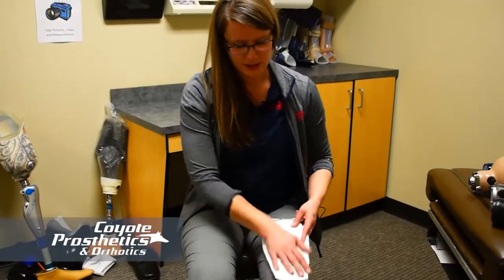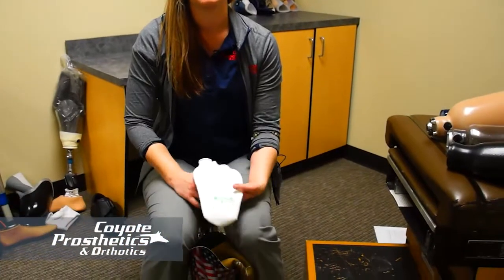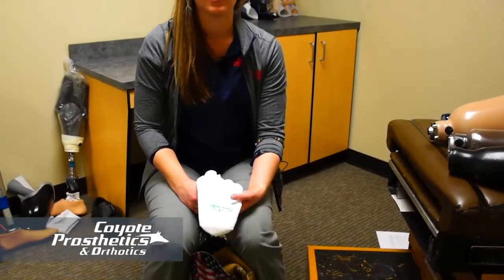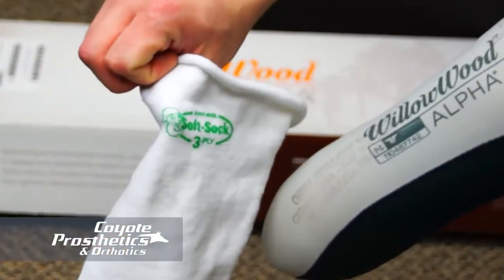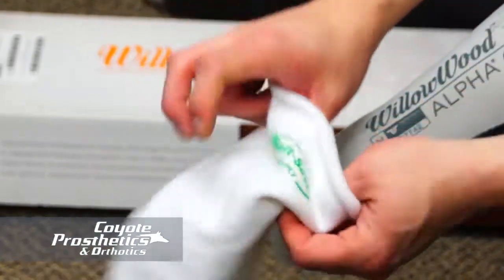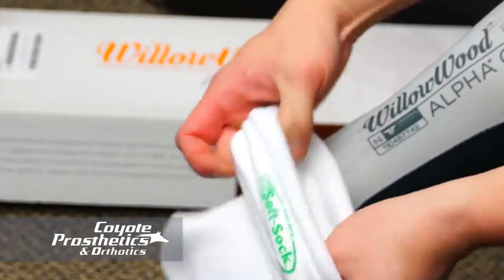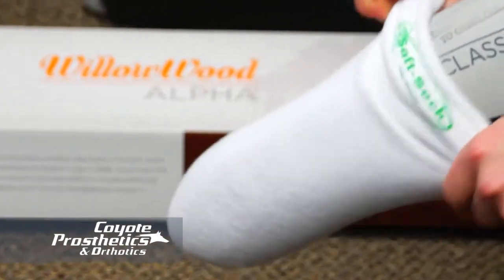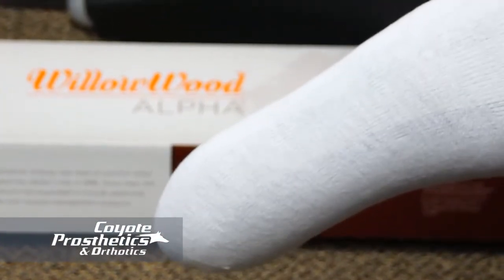And this is used just to take up some space in the prosthetic, because generally your volume is going to fluctuate day to day, possibly during the day. It is pretty common for your prosthetic to be tighter in the morning, and then as you're walking around on it, more and more fluid gets pushed out, and that'll cause your limb to reduce in volume, and that's when you're going to add a sock. A lot of people find that in the early afternoon they need to add a prosthetic sock.